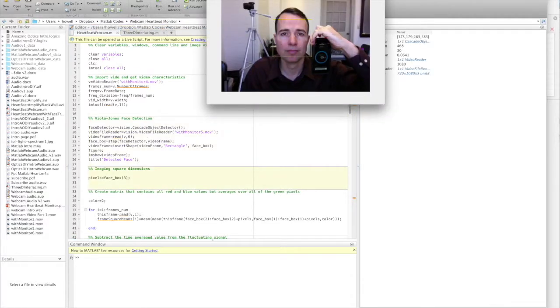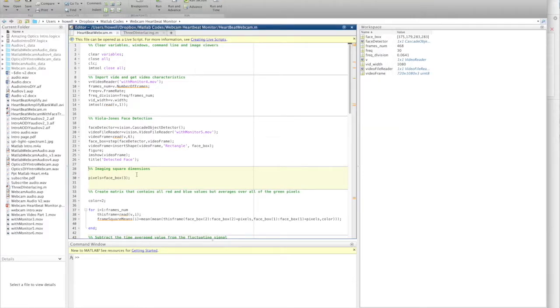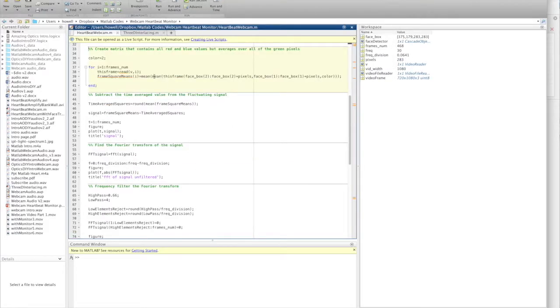In this section, we define the dimensions of the box. Let's run in advance. This section averages the green pixels in the box on my face, but keeps the blue and red unchanged. Run in advance. We have now generated a single large green box that has very small fluctuations in time. The average of this box in green may be 140, but the fluctuations may be 0.1.